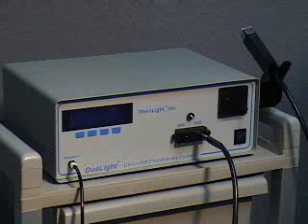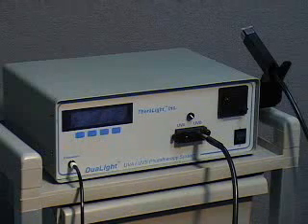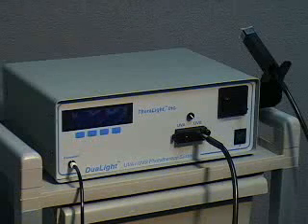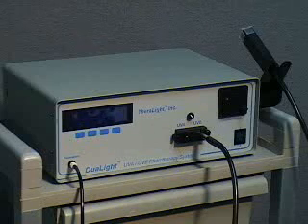The purpose of this video is to briefly demonstrate the use of the dual light targeted phototherapy system. Actual UV light dosing protocols will vary depending upon the disease being treated. However, the method of use is the same for all applications.